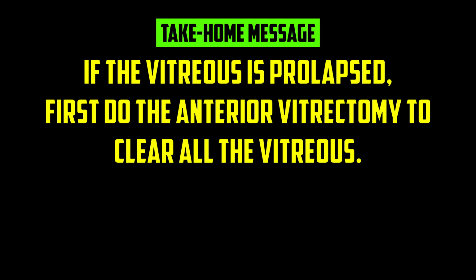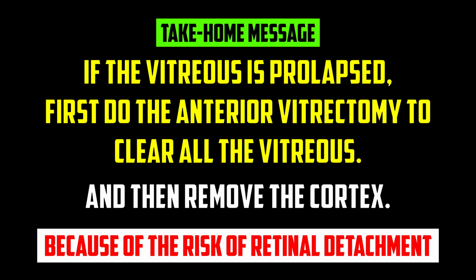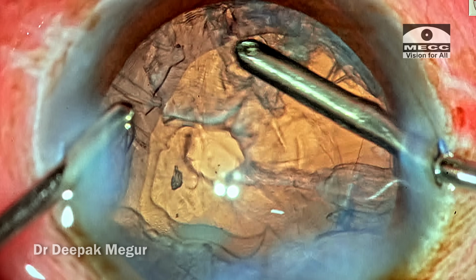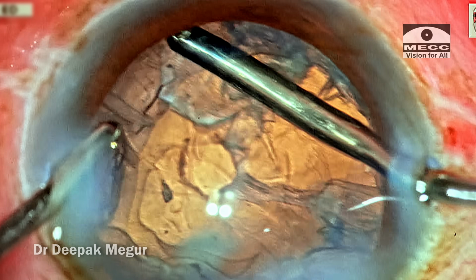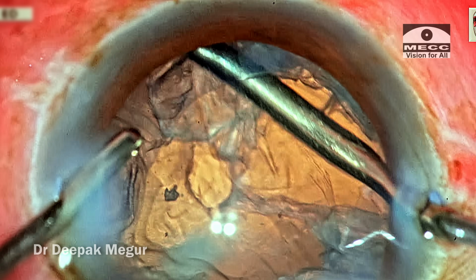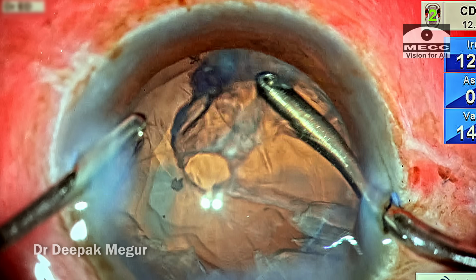So the first take-home message here is, if we are sure of a vitreous prolapse, then vitrectomy has to be done first and not cortical aspiration. In this case, I still believe that the vitreous has not yet prolapsed out, so I'm now trying to remove the cortex first. The bottle height is reduced a little bit, the aspiration and flow rate parameters are decreased, and then I proceed to aspirate the thick cortical sheet.